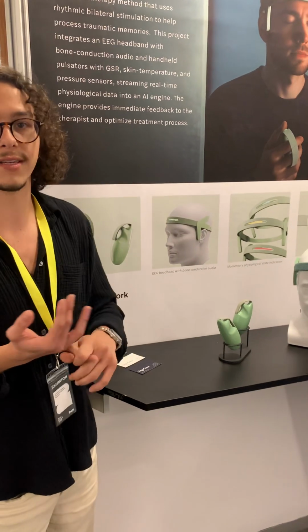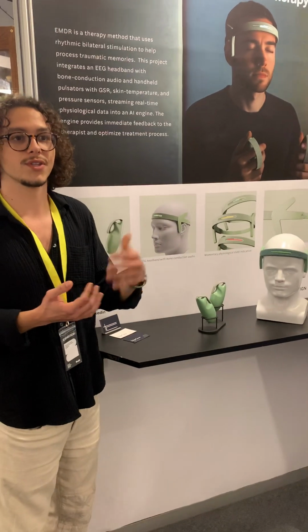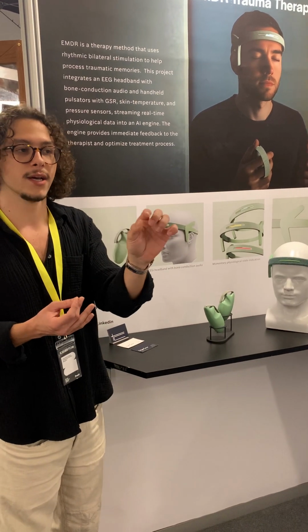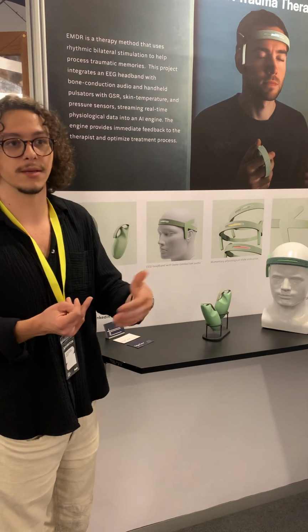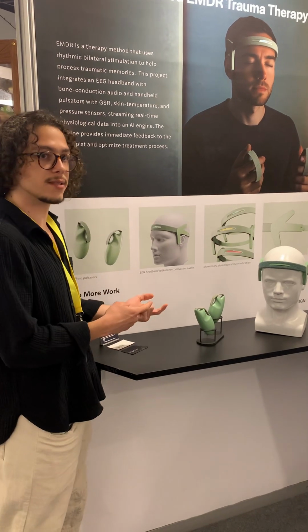One is galvanic skin response, which is especially used in lie detecting, that measures the physical arousal of the patient. Two, skin temperature, that measures small temperature shifts that are affected by the emotional state. And the pressure sensor, which measures how tight the patient holds these devices.